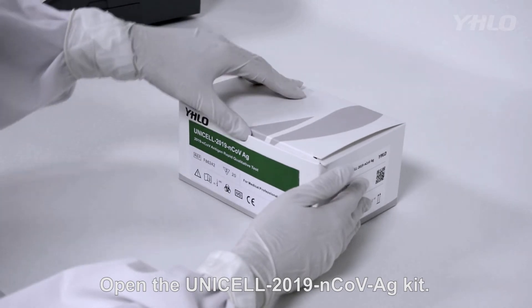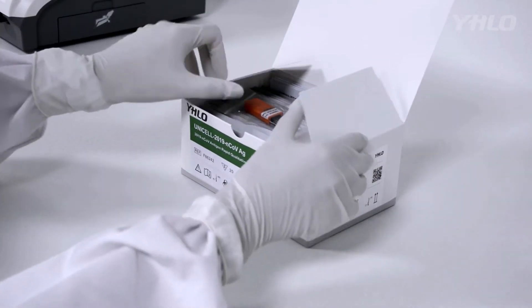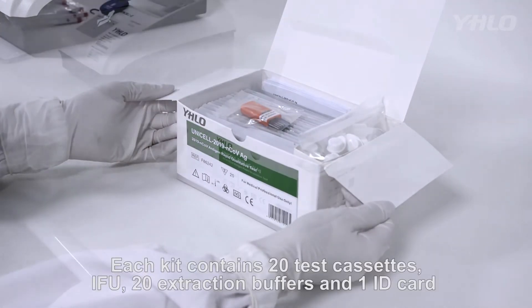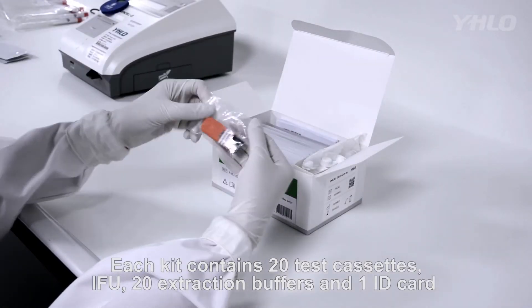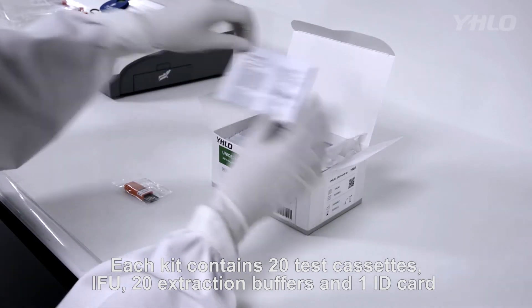Open the Unicell 2019 Novel Coronavirus Antigen Kit. Each kit contains 20 test cassettes, an instruction for use, 20 extraction buffers, and 1 ID card.